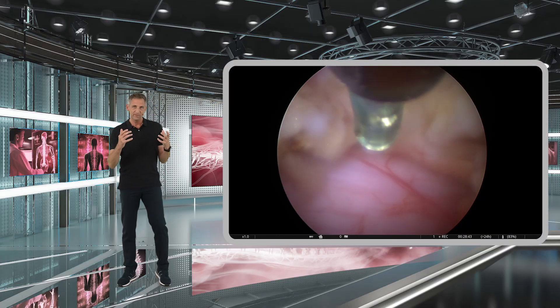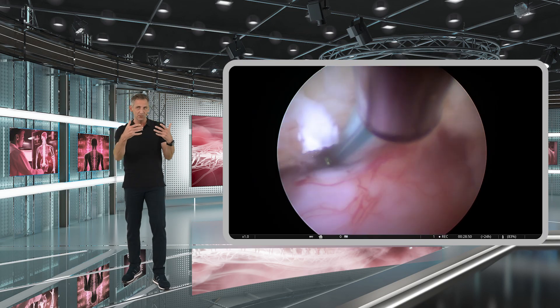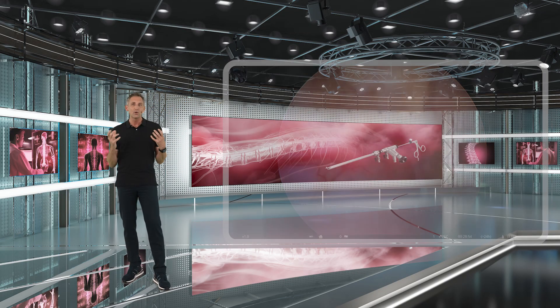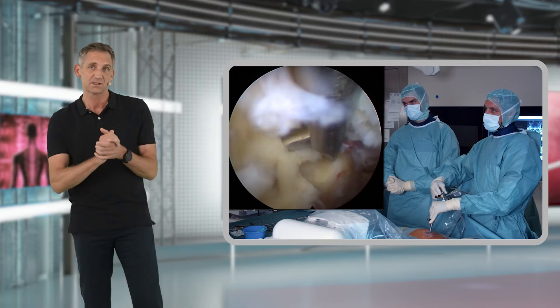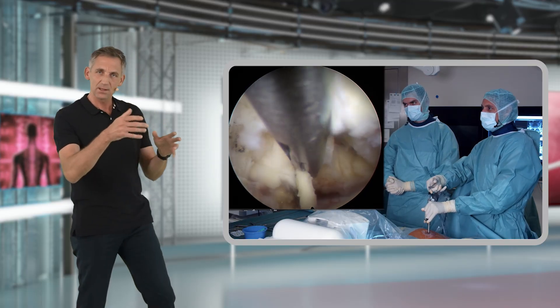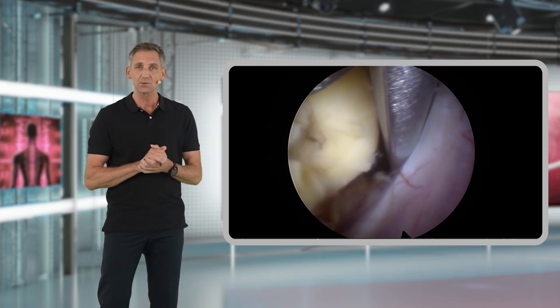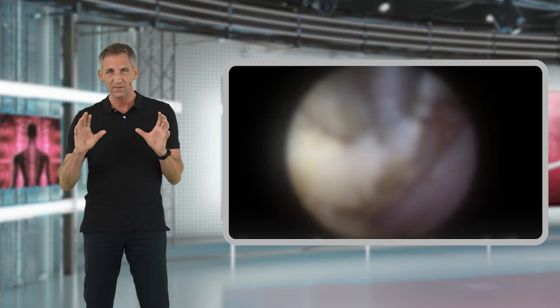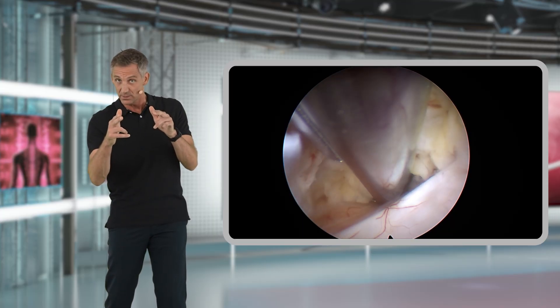Again, use the bipolar first to separate any possible adhesions between the dura and the yellow ligament and remove any fat tissue to clearly identify all anatomic structures. You can then start to resect the contralateral yellow ligament with scissors — small bites that are immediately washed out by the irrigation system. For the majority of cases, you will resect the yellow ligament with Kerrison rongeurs. Make sure to use the 25-degree angled optics and rotate the endoscope so you can see the tip of your sharp instruments at all times.